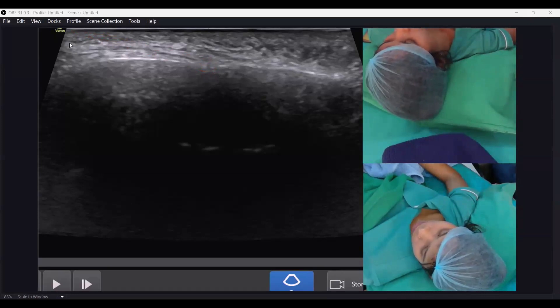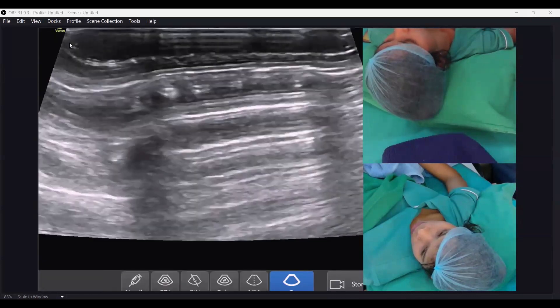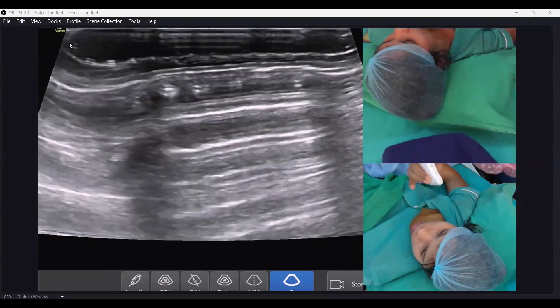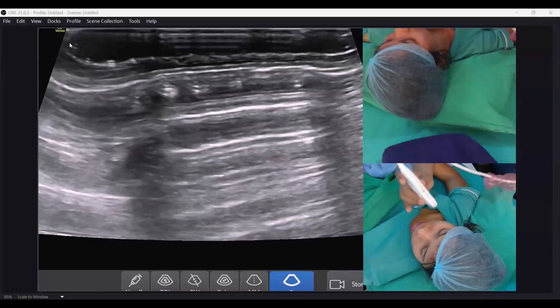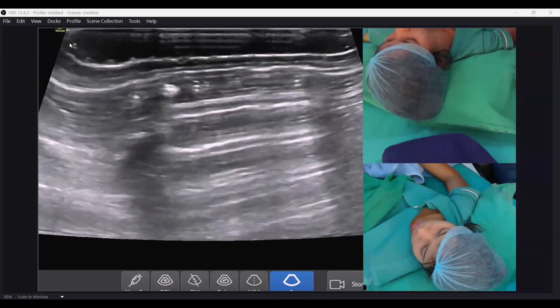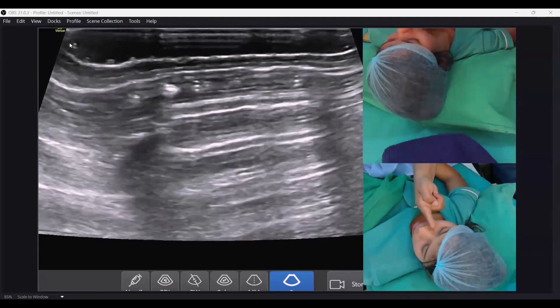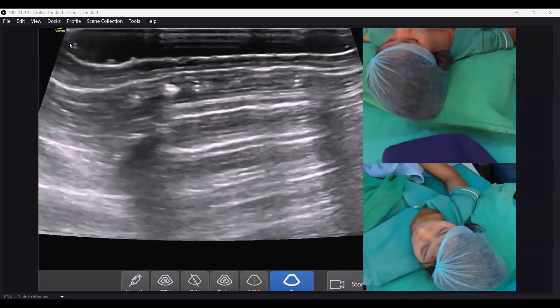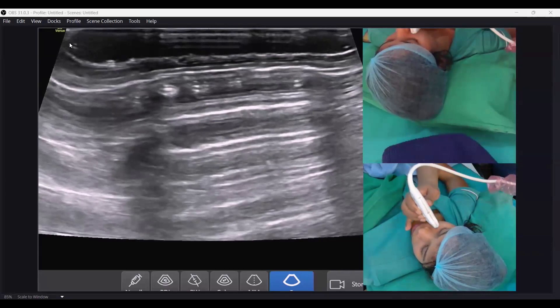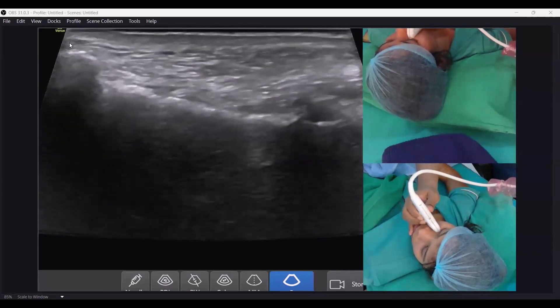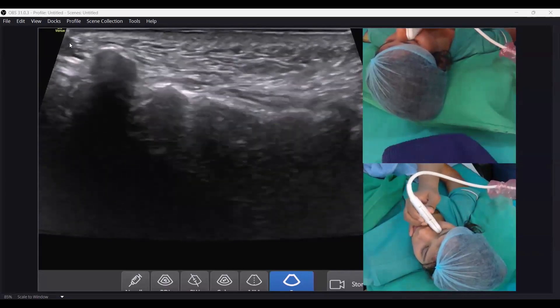What I am doing is putting my aspect marker towards the proximal side. That means the left hand side of the screen is the proximal side. Ask the patient to close the eye. There is a depression between the nose and the maxilla bone — you just put the probe in that depression. It's very easy, very simple. I am putting the probe there. Can we appreciate the pulses in here?